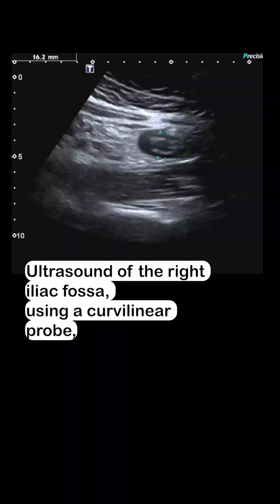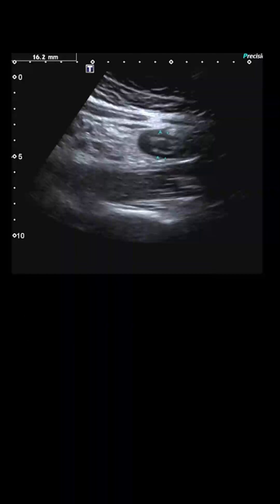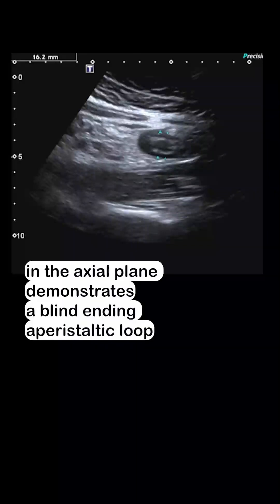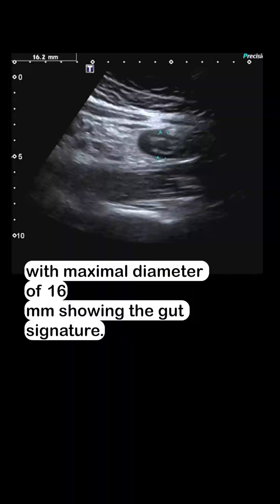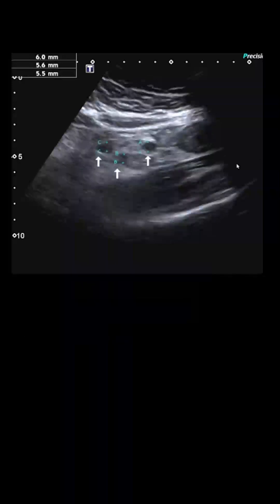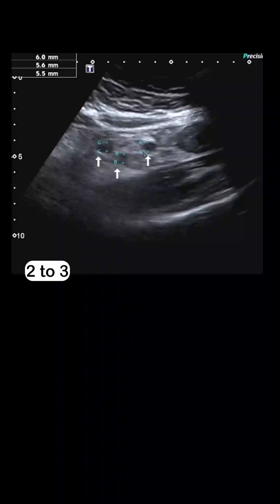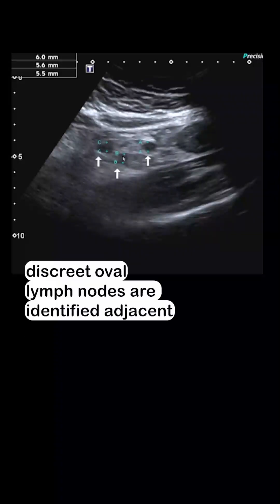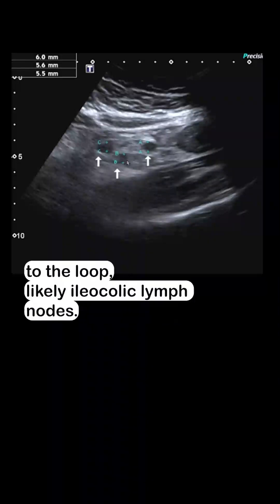Ultrasound of the right iliac fossa using a curvilinear probe in the axial plane demonstrates a blind-ending, aperistaltic loop with a maximal diameter of 16 mm showing a gut-signature nature. Two to three discrete oval lymph nodes are identified adjacent to the loop, likely ileocolic lymph nodes.